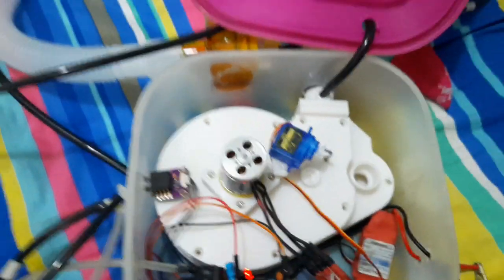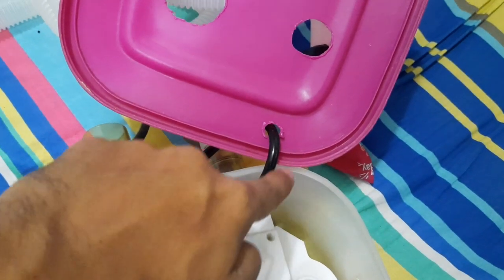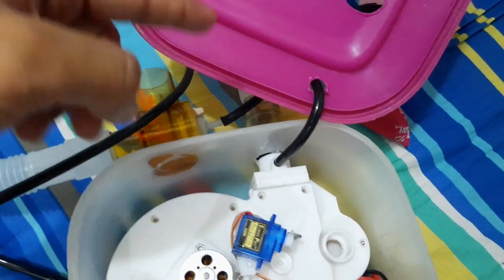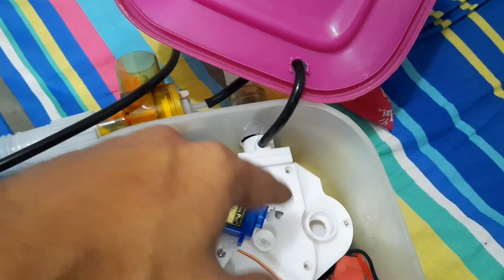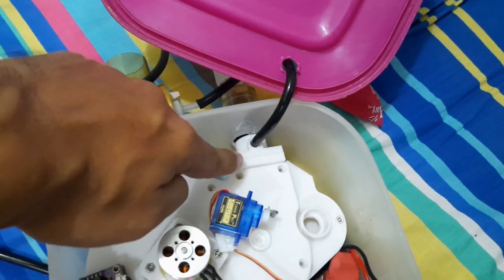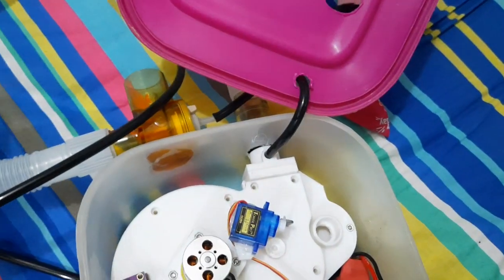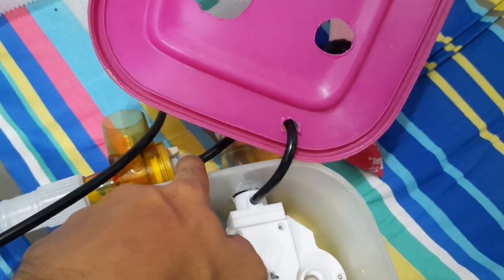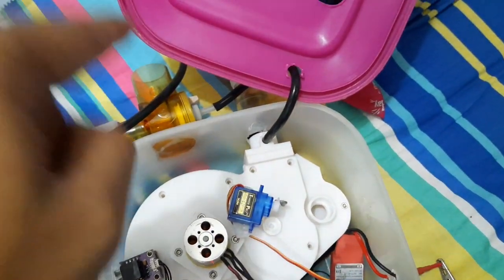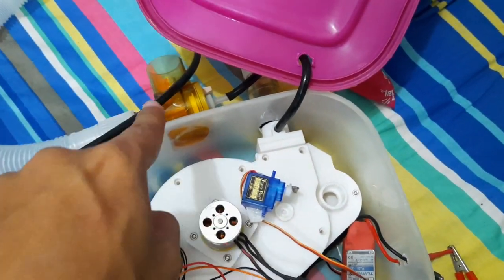pressure control. And one of the interesting things is this PEEP valve is actually controlled by this air pressure. So when the inspiratory line is open, that means the pressure is high, then it will close automatically, and when we release the pressure here, this PEEP valve opens and maintains the PEEP by using this air pressure. And this air pressure here, we have designed a very efficient PEEP valve which is not in here, but our PEEP valve is more efficient than this professionally made PEEP valve.